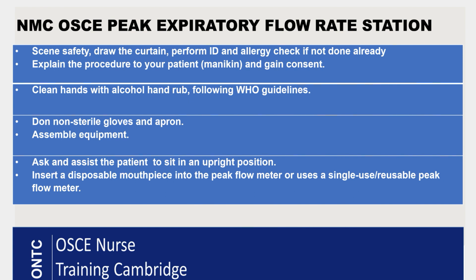If you have, just say, as per my briefing, my ID check and allergy check has already been done. If not, then go ahead and do that against your documentation. Ask your patient for details and check them against your document. If they're wearing a name band and allergy band, check that as well. So your ID and allergy check is complete.